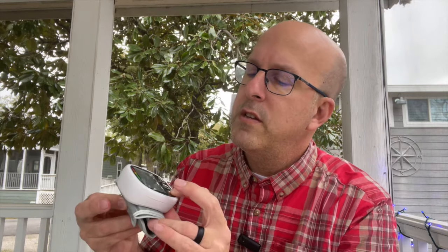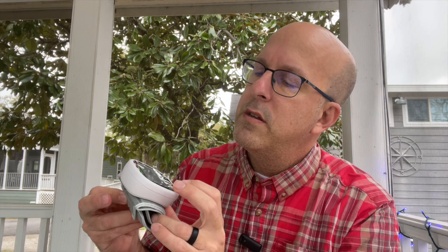Let's pull the blood pressure monitor out of the wrap and see if it actually has a charge to turn on. Apparently it does — it talks to you as soon as you take it out of the box, and it's actually running. So the blood pressure monitor itself allows for two users and 99 memories per user, meaning it saves 99 tests for each user.